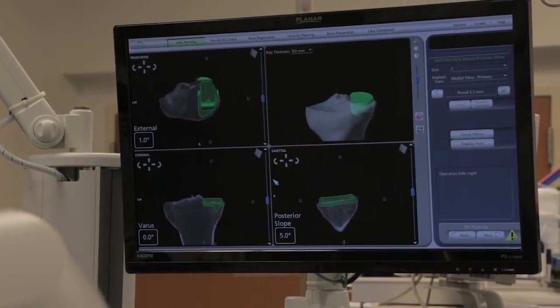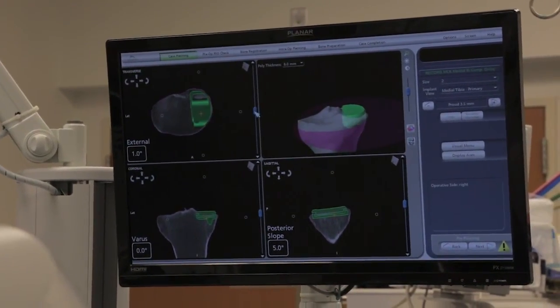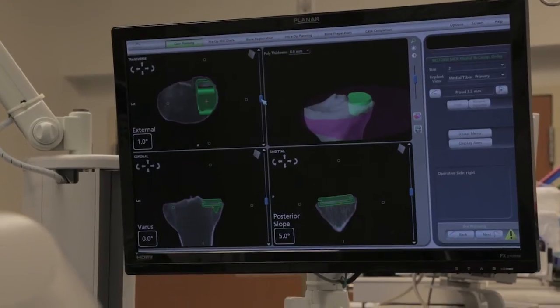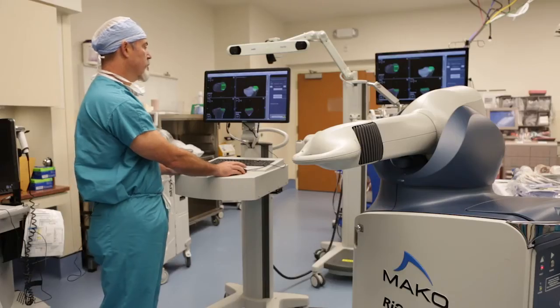I go up to the axial view, which is the best view for looking at overall size. I can see that the size 2 fits well within the plateau — I've got good cortical rim support. That looks like the size I'm going to select.